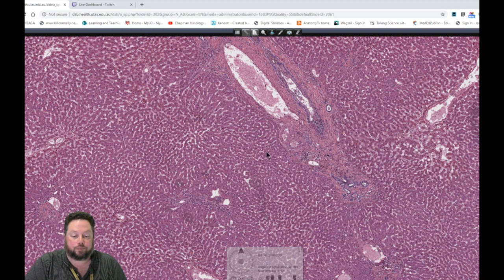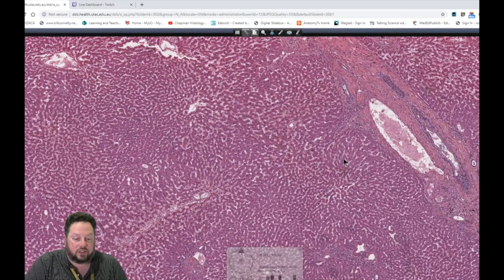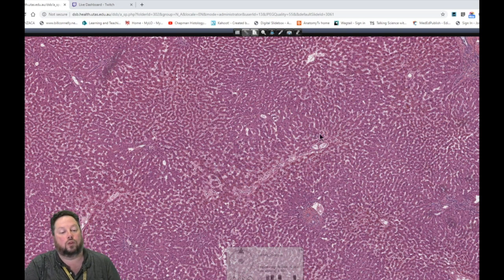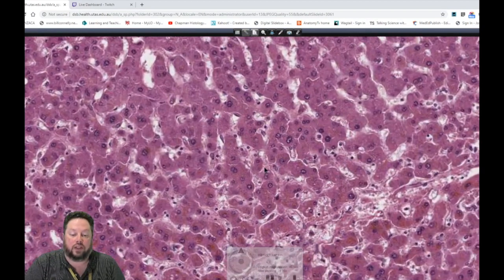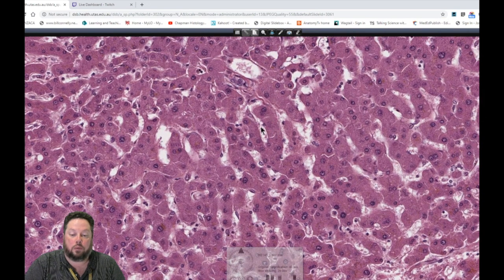liver structure. So getting to James's question, this is the human liver. You can see we can get a little bit of idea about where some of the stroma is, but we don't have that lovely defining lobule-like structure that we see. What we look for when we're looking at a section, the cords are usually really well defined for the hepatocytes. So we've got these lines or these cords of hepatocytes with the white spaces in between them. So that's what I'd be looking for.